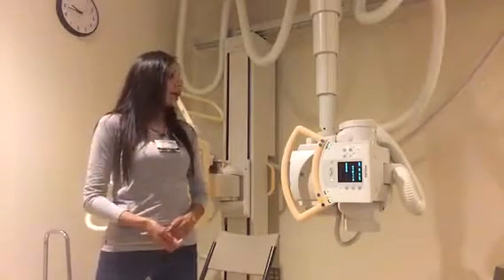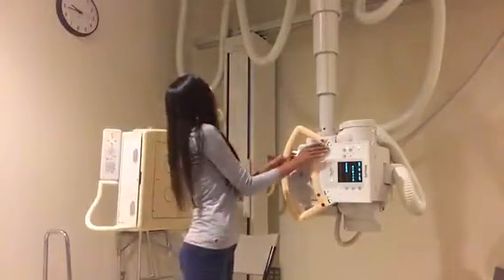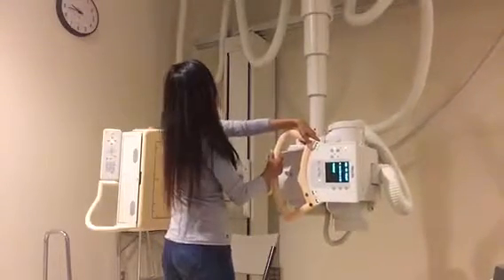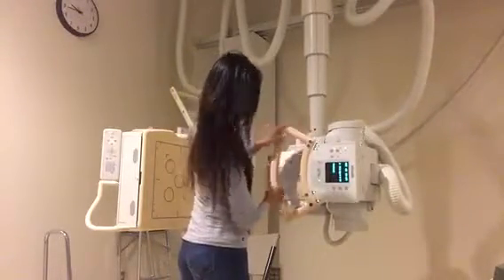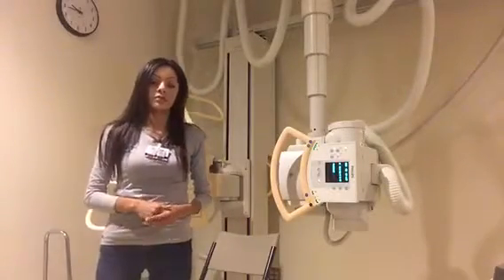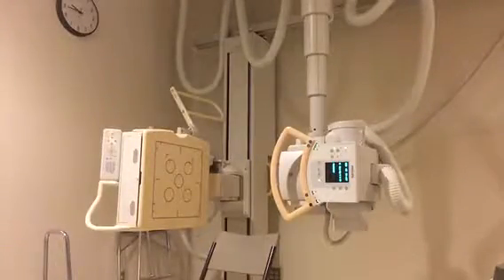So first I'm going to make sure that my room is set up and that I am detented. So now that I am detented, I'm going to go ahead and call my patient. Anne-Marie Montalvo.